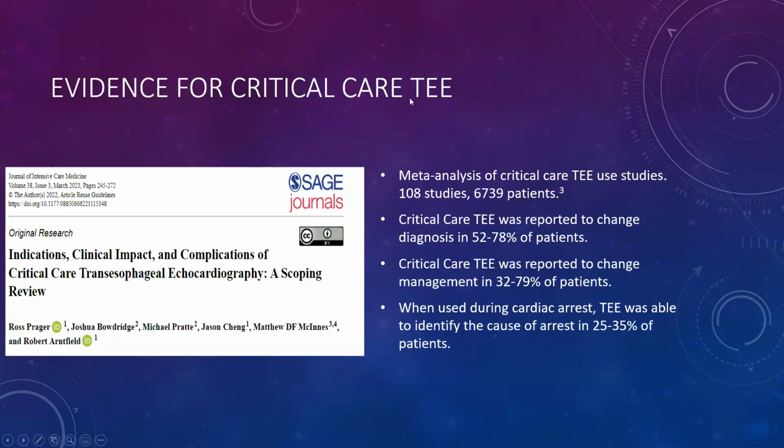Obviously, this is a very wide range of patients, but you can see that even if it's changing your management in 1/3 of your patients, that is a ton of patients. The number of people that we have in critical care settings who go into undifferentiated shock, this can really be helpful for you when you don't have other modalities to provide you your management and diagnostic information.